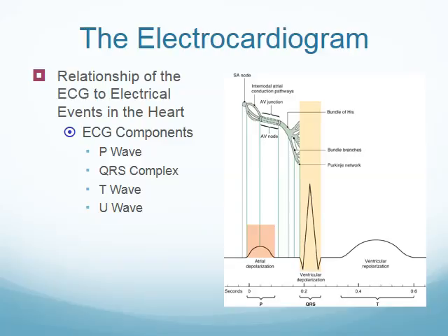After this, remember on our action potential slide, we saw that as potassium is being pumped out of the cells, the ventricles are repolarizing to become ready for the next stimulus. They have to repolarize and get back to their previous state before they can receive another stimulus to pump again. So that's what's occurring here at this phase. Atrial repolarization is not normally seen on an EKG. It occasionally can be seen, but most of the time it's hidden by the QRS complex.